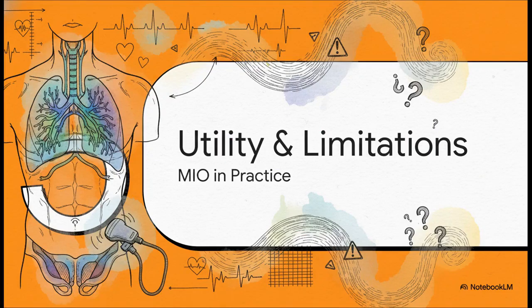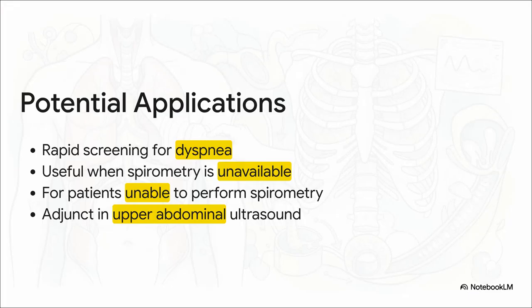So what's the bottom line? Where does this tool fit in our day-to-day practice? And, just as importantly, what are the caveats we need to keep in mind? Well, the potential uses here are pretty significant. I mean, think about that patient with undifferentiated shortness of breath in the ED. This could be a super fast screening tool to point you towards an obstructive cause.